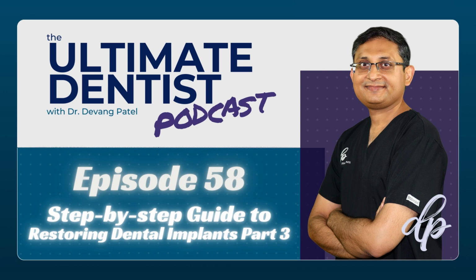However, it's best to use a custom abutment when you're using a cement retained crown. Now, custom abutments are not stock abutments. Imagine you have a stock impression tray, which comes in certain sizes like 11, 12, 13, 14, and you have custom impression trays. Same thing with abutments. Stock abutments are made by the implant companies, with a certain height and width, and you place them in the implant; that's what you get off the shelf. Whereas a custom abutment can be almost whatever shape you want. You can mill that abutment like a crown from chrome or titanium.